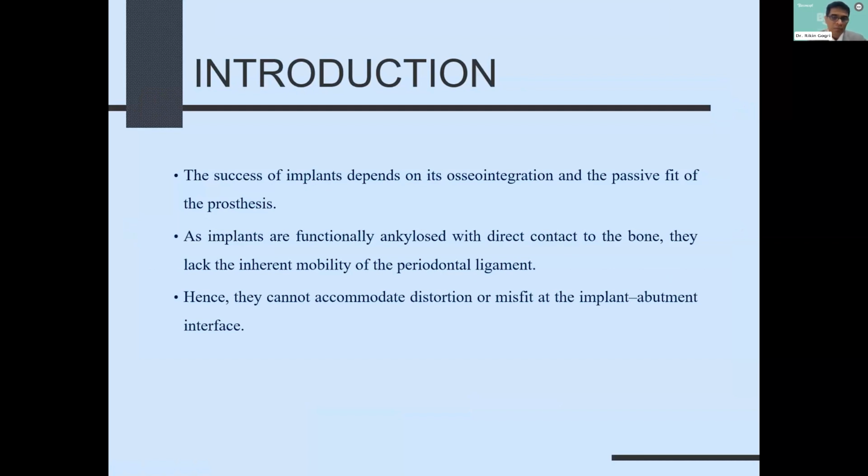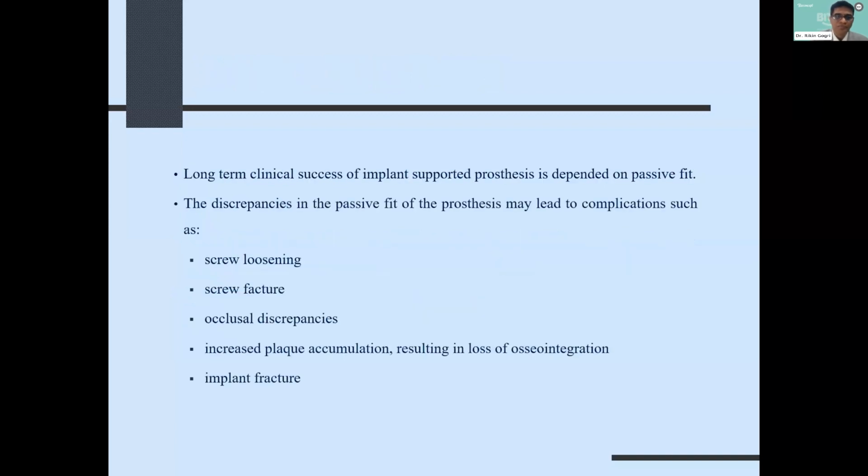That you don't want your implant seated in one particular position, which is a rigid component, and you try to fix another rigid component through the help of the abutment screw, but which is not seated perfectly or angled in an ideal way to dissipate the occlusal load, then we are going to have issues with the survival of the implant or the success of your prosthesis.